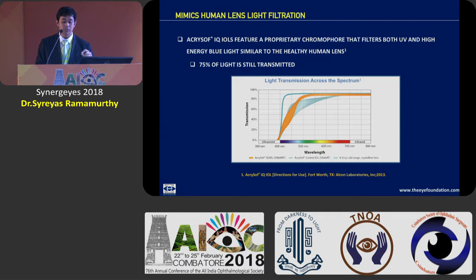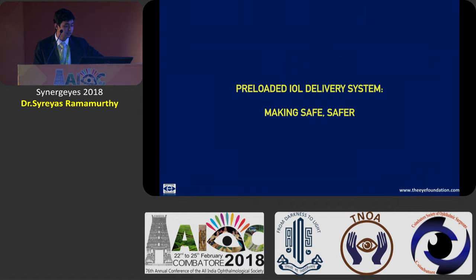The Acrysof IQ, as I earlier alluded to, has the proprietary chromophore technology, which ensures that the harmful rays are not transmitted and filters both the UV and the high energy blue lights.